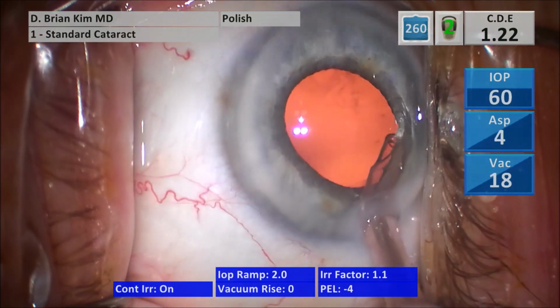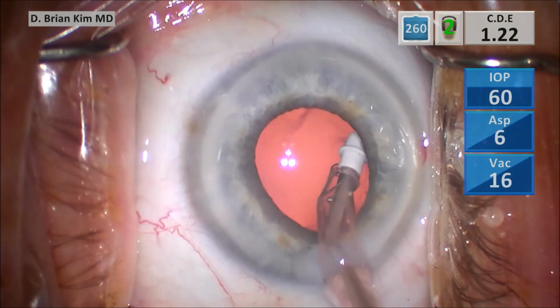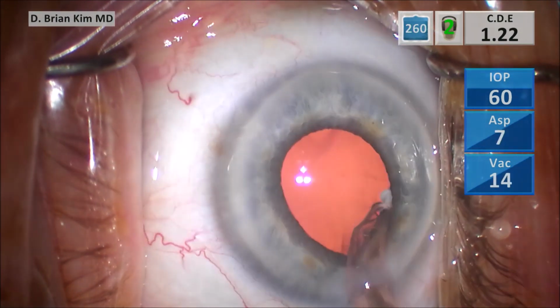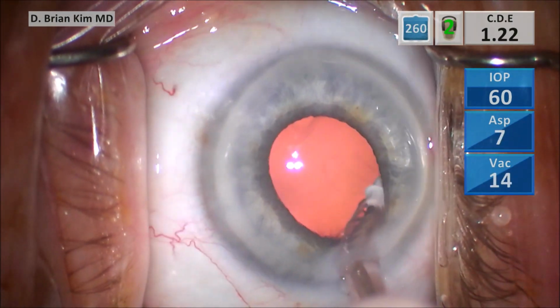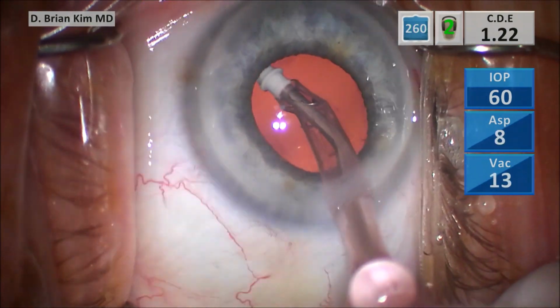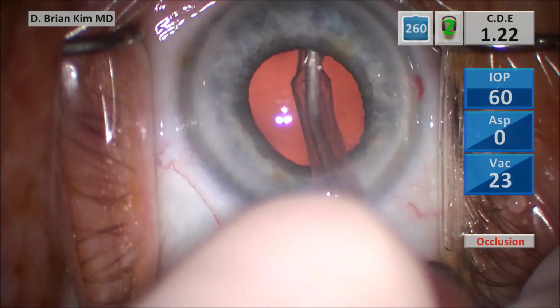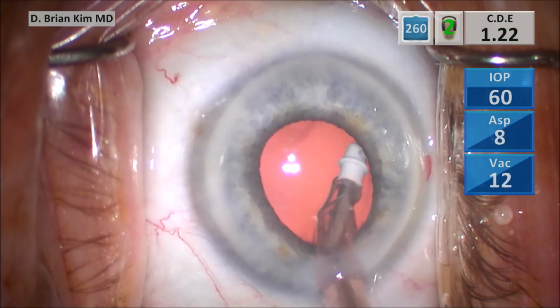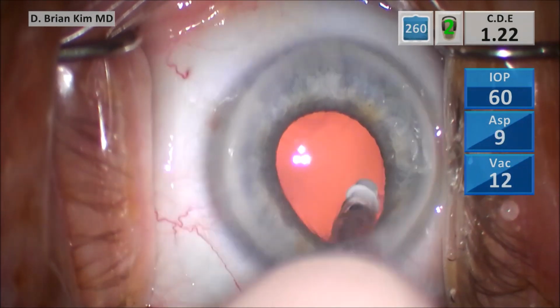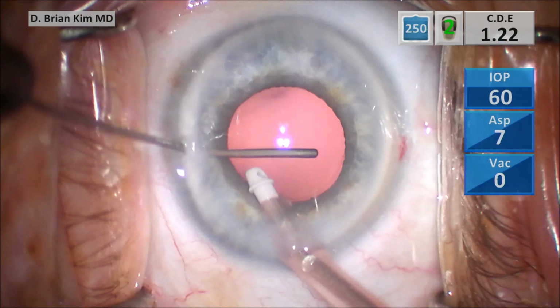Switch to polish mode and going under the rhexis edge more confidently, knowing that I'll be able to polish and remove lens material without accidentally grabbing the capsular bag. Polishing also the posterior capsule, because there's some fine lens material that's adherent there. Getting to that subincisional space, there's some adherent material there as well. So I use a cannula to pulse the subincisional capsular fornix here.